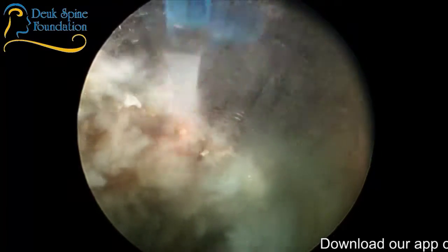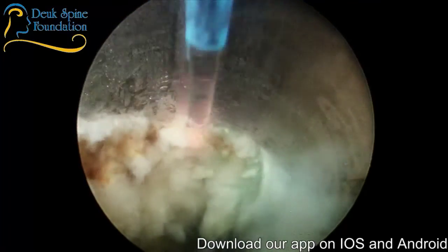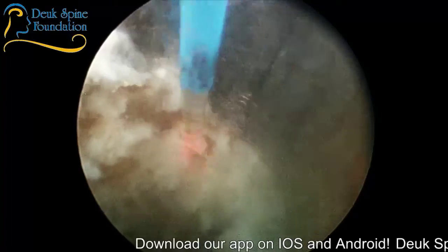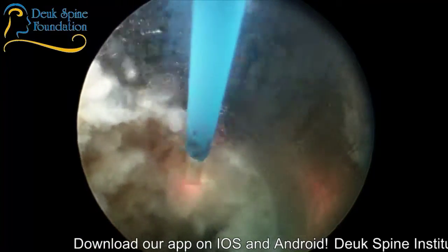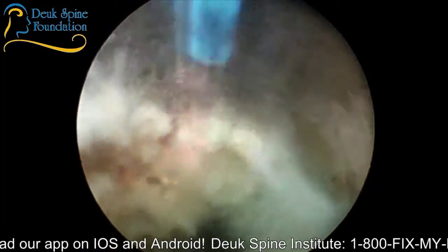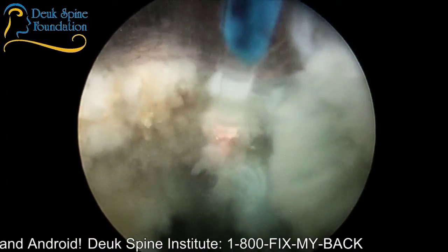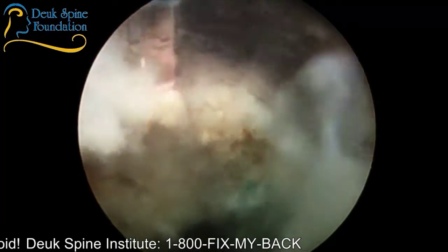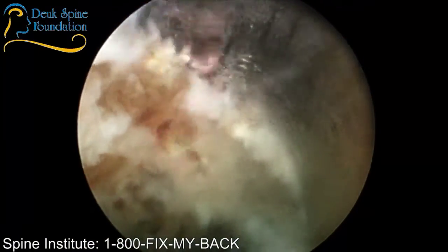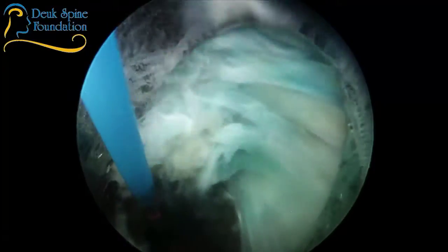It's kind of like they taught me how to make a rifle, and I turned around and made the Gatling gun, which I know may be offensive to some people, but technologically it's more advanced. Functionally it's more advanced. It's heavier, but it has, I think, better results in many ways. Not that I'm a proponent of the use of guns, because I'm not. But you understand what I'm saying? I took something that existed and I made it a lot better. Just one small change. I mean, I made several changes, but I think the most significant change was the debridement of the annulus.